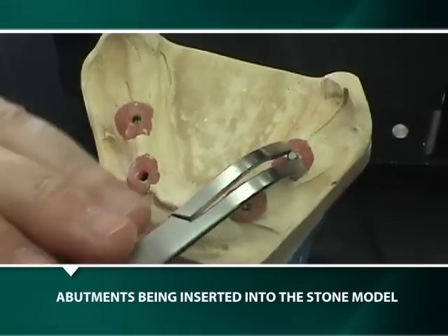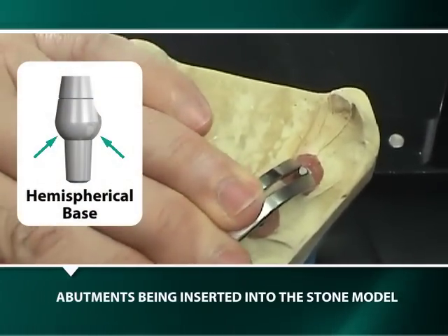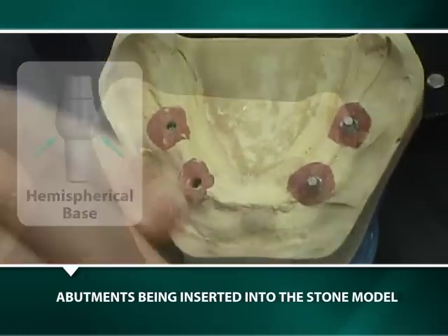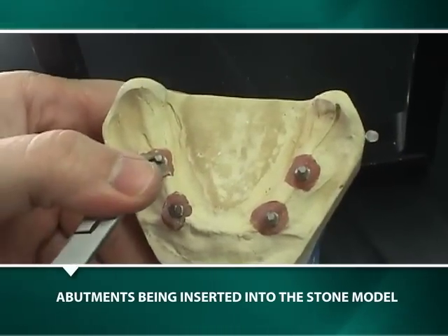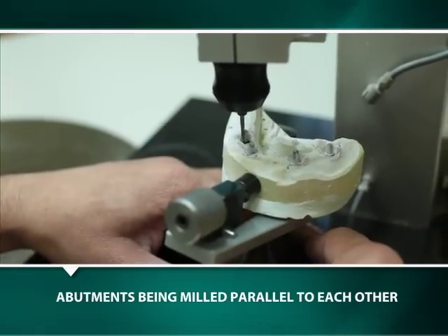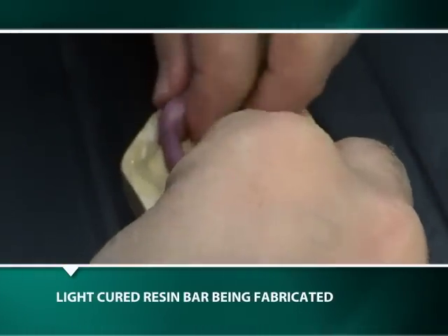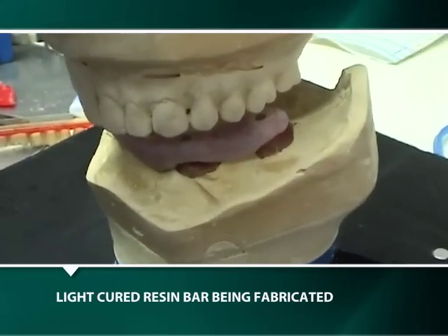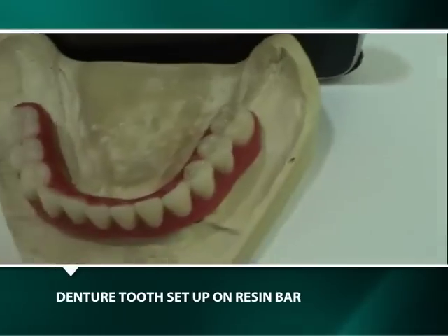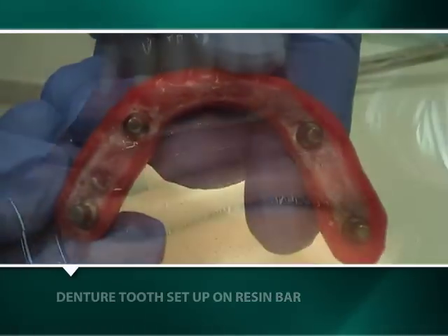After articulation of the models, appropriate abutments with the largest practical hemispherical base are selected and inserted into their corresponding implant analogs within the stone model. Their prosthetic posts are then milled parallel to one another. The model with the milled abutments is used to fabricate a light-cured resin bar and denture tooth setup for an intraoral confirmation of the arranged teeth.